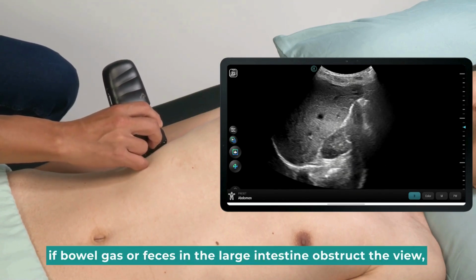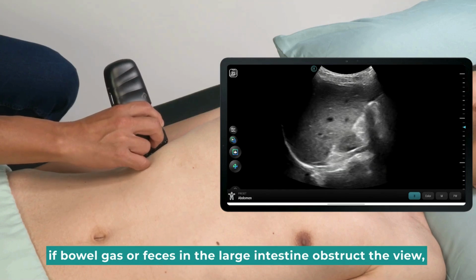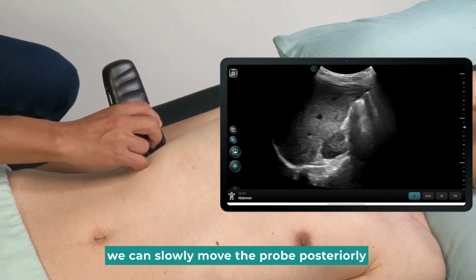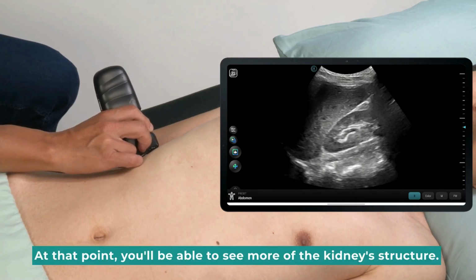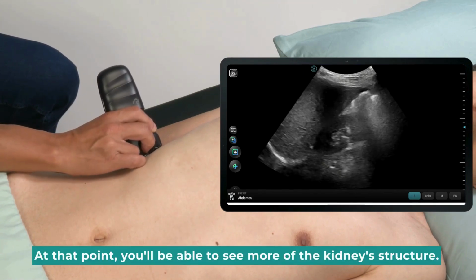If bowel gas or feces in the large intestine obstruct the view, we can slowly move the probe posteriorly to make necessary angle adjustments. At that point, you'll be able to see more of the kidney's structure.